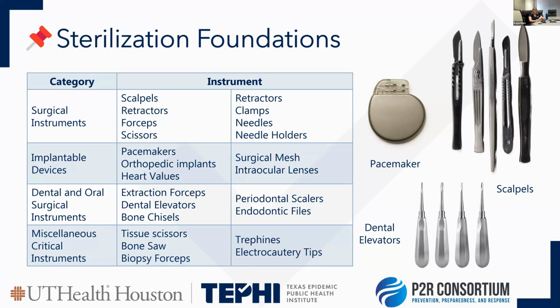So in case the surgical team undergoes any hiccups during surgery, such as the device is too big, it's too small, or someone accidentally drops it on the OR floor, you have another device ready to go and you don't have to make any type of flash sterilization or other difficult choices or keep the patient under anesthesia until you get another implant ready to go, with an increased risk of being under surgery for a longer time.